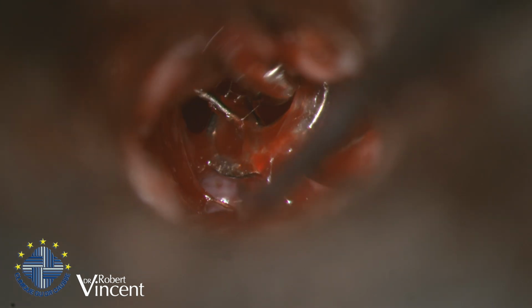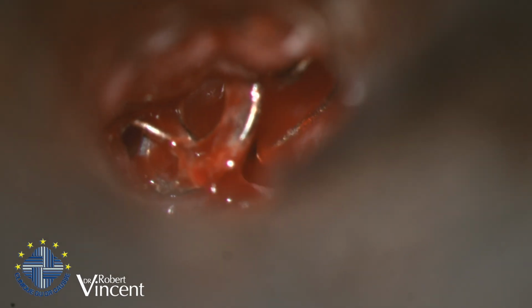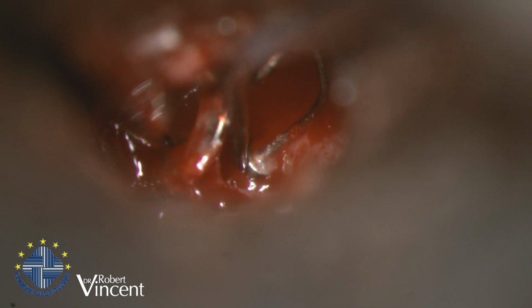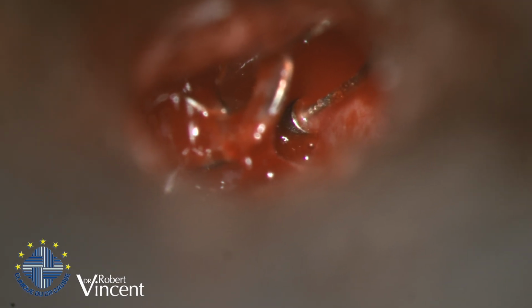The previous prosthesis which was used is this one, with a titanium head with a strange shaft coming through. The other part of the shaft, which is also very strange, has been bent, maybe by the previous surgeon, in order to reach the tympanic membrane on one side and the stapes footplate on the other side. So I need to remove this prosthesis, which is not working at all. You see, there is no contact to the footplate. So I need to dissect it and then remove it and see what I can do.